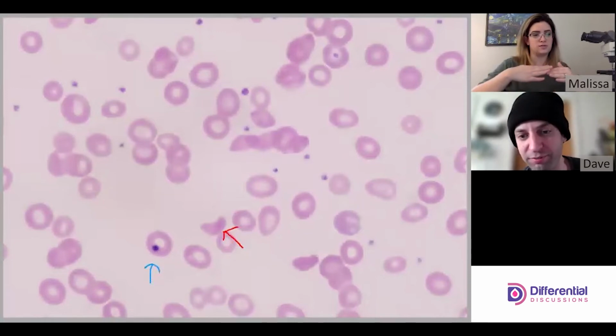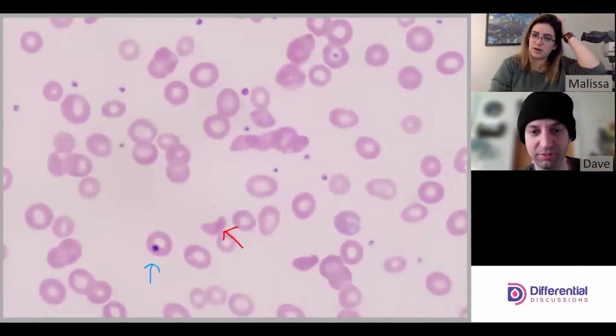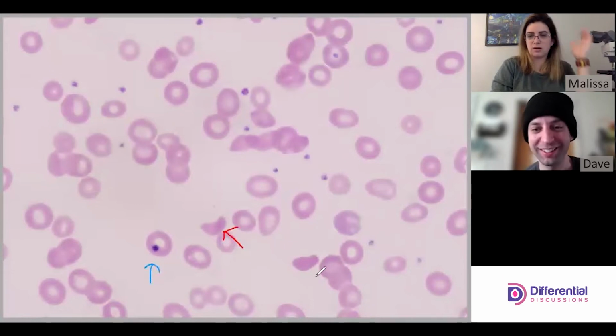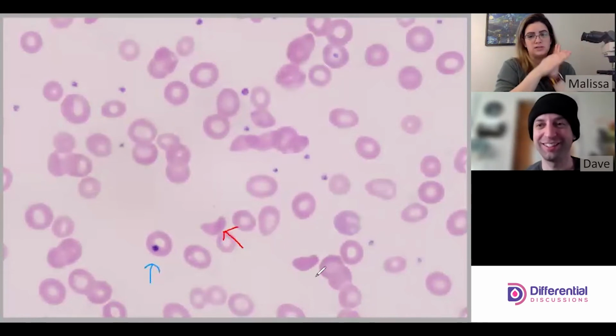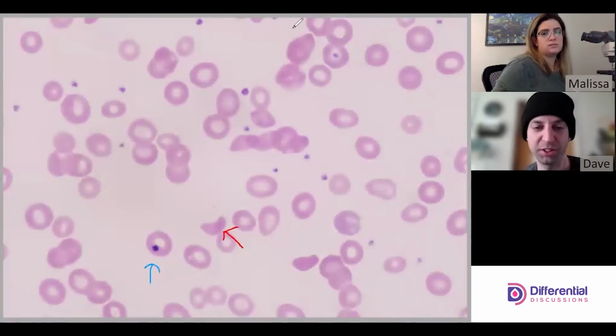And sometimes they fold up like that, and sometimes they fold over. Yes. So you get one of the sides folded over, and it looks similar. I think this one has it. You can see right here, it kind of looks like there's a whitish line right there. So it's probably folded like this. Yep. Typical of sickle cells. So we definitely want to call those sickle cells.